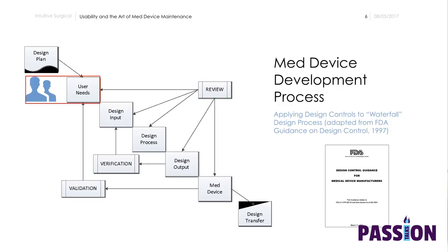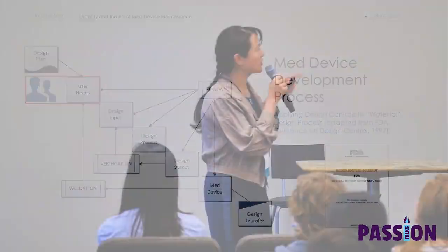Don't be bothered by the flow chart, but this is very characteristic. FDA put out this guidance as the typical way for how you develop a medical device product and the cycle. I think the key part I wanted to highlight is the inputs: you need to understand your users and their needs. And so that's the real start to the cascade for this whole process.